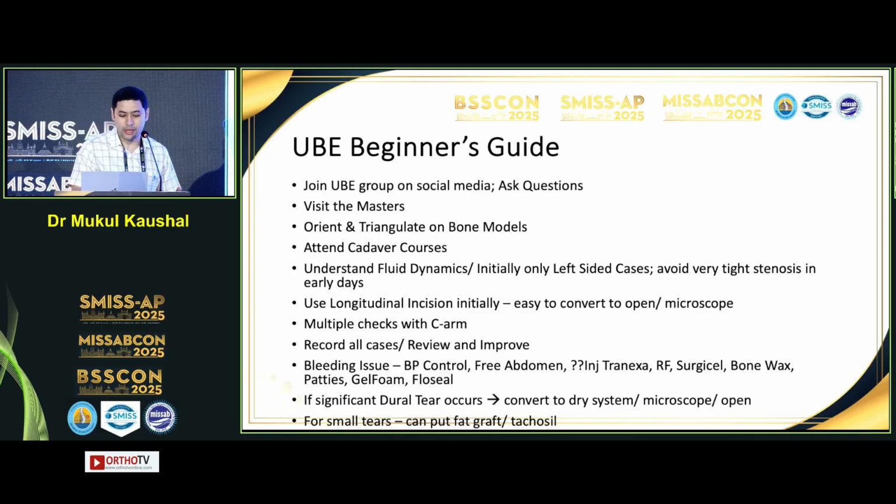Radiofrequency probe, Surgicel, bone wax. I also use cottonoids, gel foam, and flow seals.